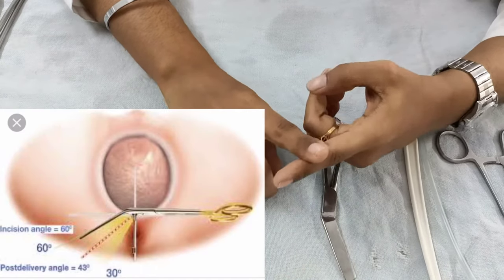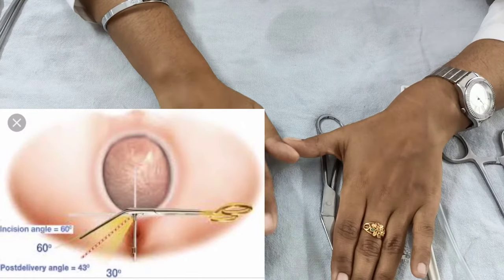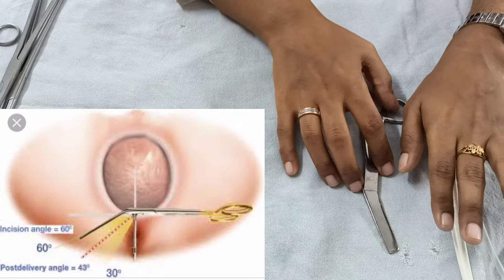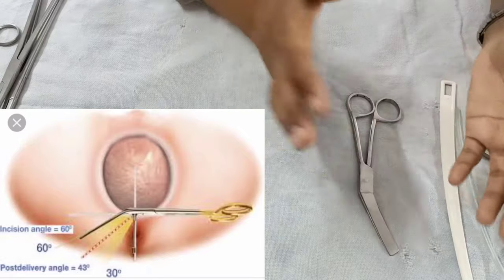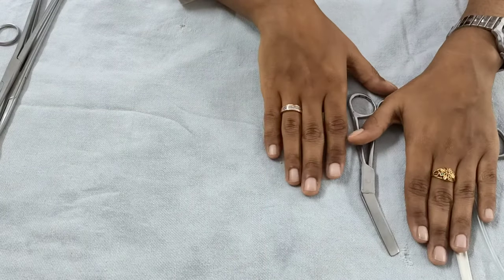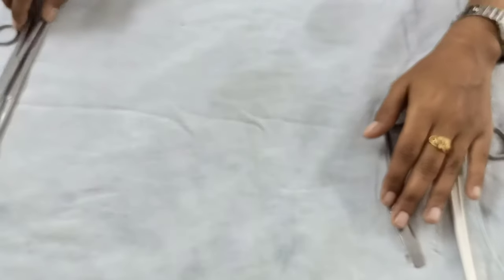The episiotomy made at a 60-degree angle will, after delivery of the baby, end up at about 45 degrees. Now that your baby has delivered, the next thing you require is a pair of cord clamps.